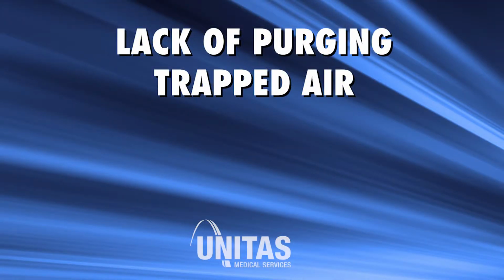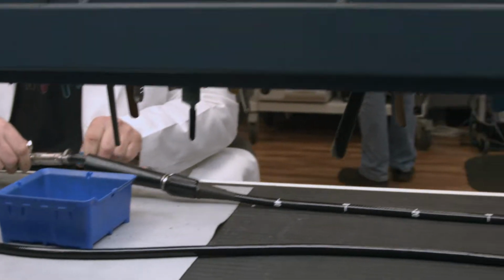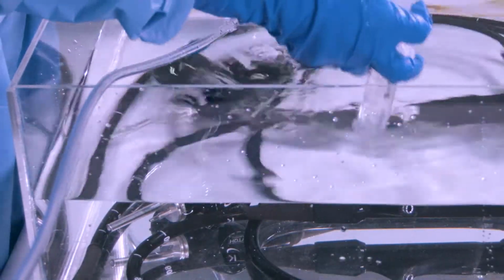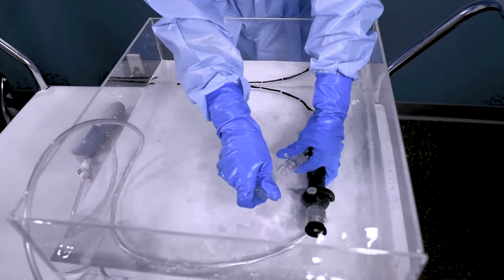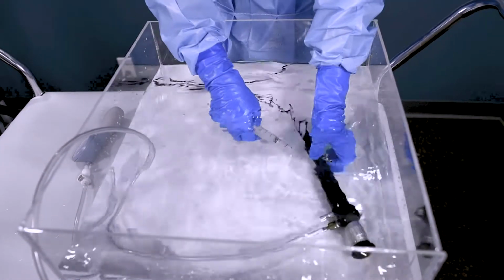Lack of purging trapped air. The endoscope channels are like long, open-ended straws, and air will be trapped, especially for longer, multi-channel GI models. The trapped air looks similar to a leak as the air displaces. Purging air from the channels prior to examination will eliminate this. Pushing water through the channels via a syringe until no air bubbles remain will eliminate the question: is this trapped air or a true leak?